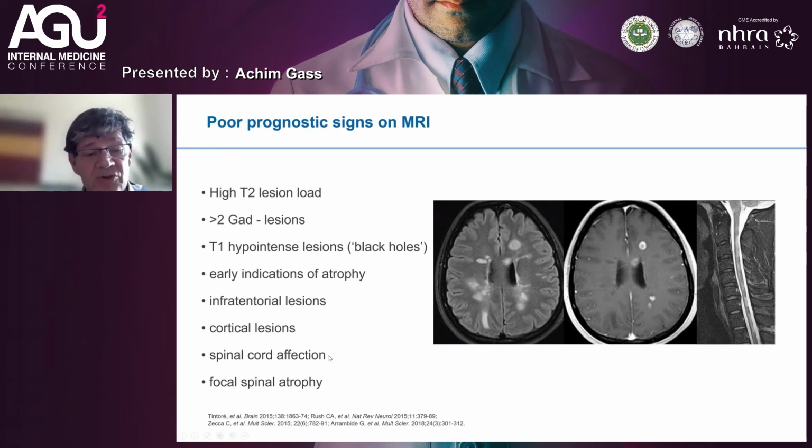So our trend has been in the past integrating such spatial topographic information coming from MRI and disease activity to sensitize ourselves for patients who are at higher risk to develop clinical disability early, and therefore be as active as possible with treatment with those candidates.